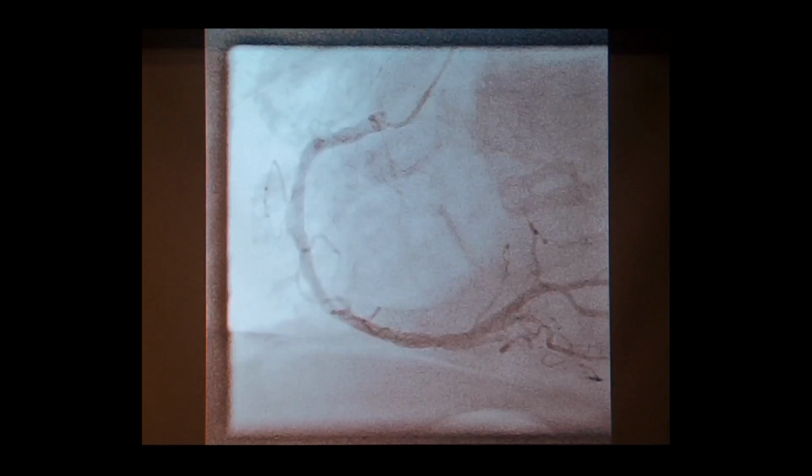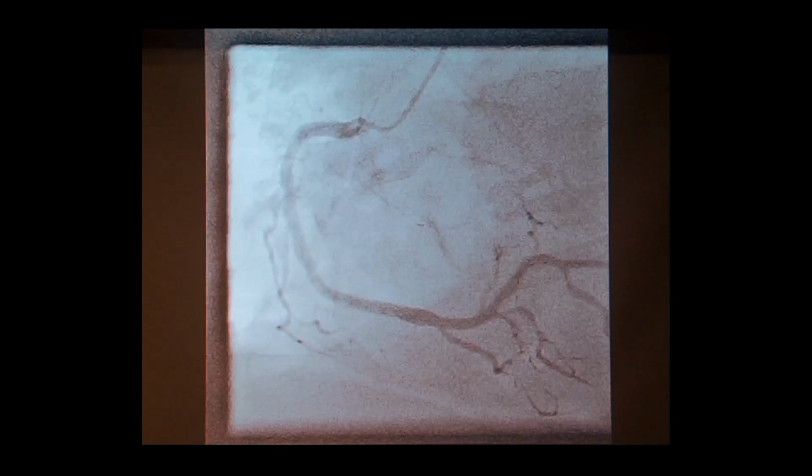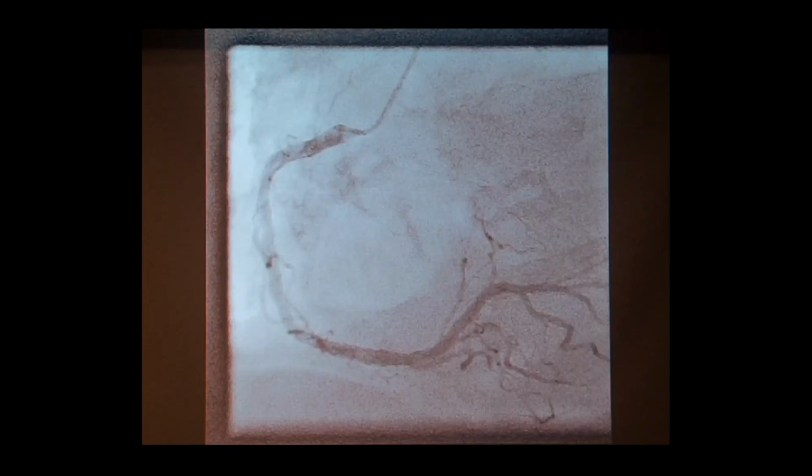So when we take them to the cardiac cath lab, we either go through the wrist artery or through the groin artery, and usually get a picture of the vessel which we think is not blocked first, because we just want to make sure, in case the patient needs emergency heart surgery or something, exactly what the circulation is in what we think is a relatively normal vessel. And that is a normal right coronary artery, which is going around the heart. It's a huge artery, as you can see, and that artery has got bits and pieces of narrowing here and there, but nothing too terrible. So we are now happy, this looks okay, so we can move on and fix the problem.